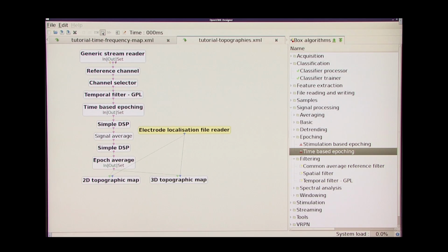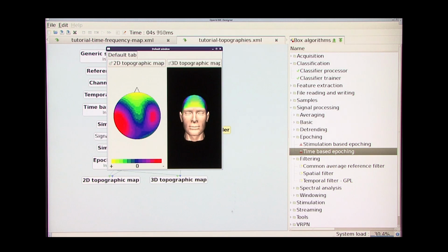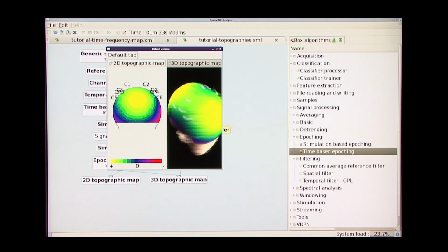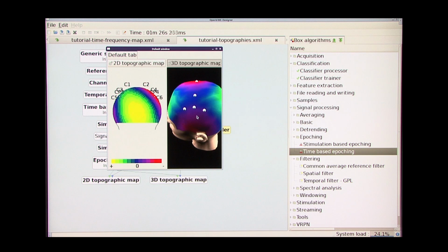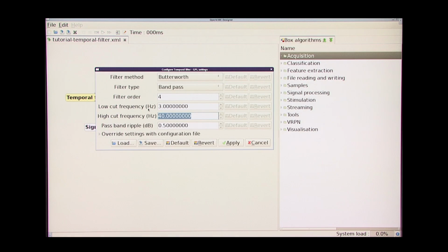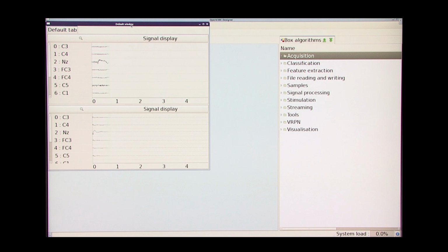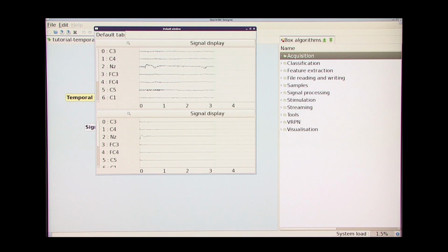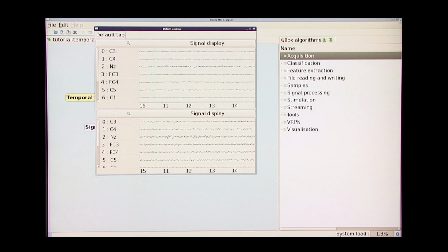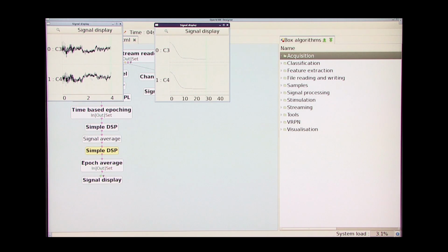OpenViBE handles electrical signals transmitted from the surface of the user's skull. Depending on sensor location, as here for example on the right and left hemispheres, the software can link together a whole series of tasks represented by small basic blocks. The brain-computer interface uses the following signal processing logic. A data acquisition phase is followed by a signal noise reduction process. Next comes a data extraction phase that keeps only the frequency range corresponding to hand or foot motor activity, for example.